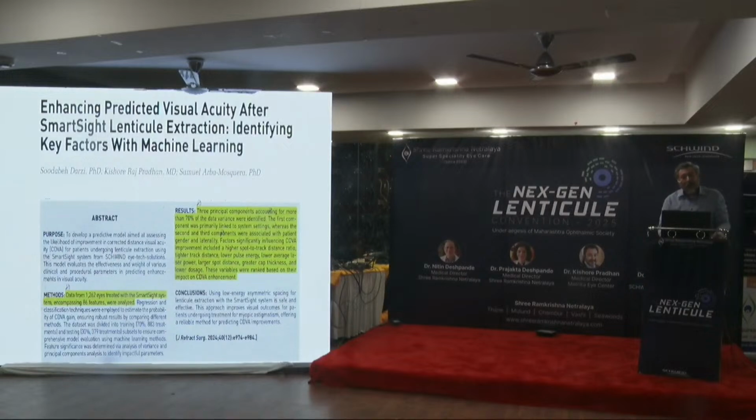And then we did a study where we took about 86 parameters in the laser to learn what are the things that actually affect the visual acuity. Sorry, I'm taking a little longer. I'll try and finish up fast.